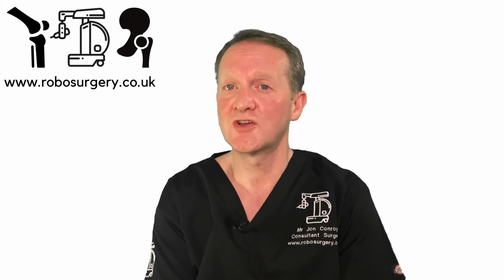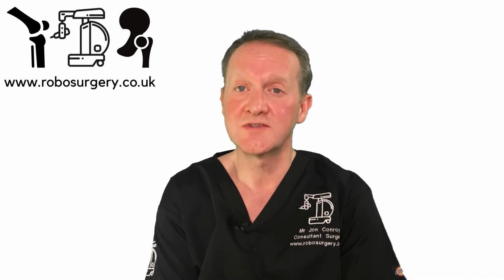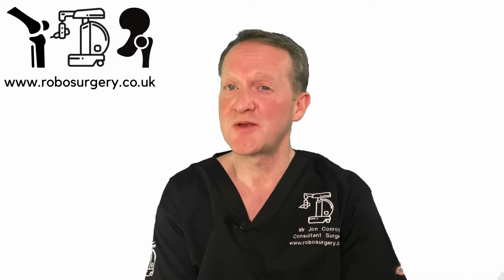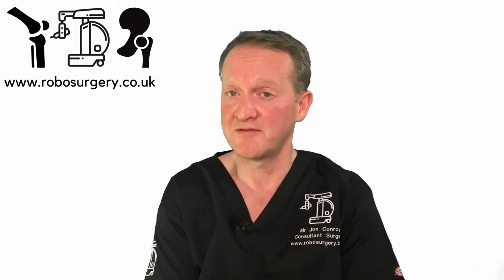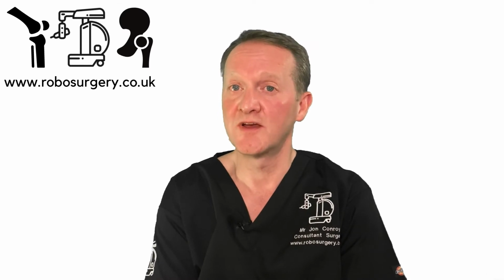It gives the surgeon the confidence when they start the procedure that they know exactly what problems they may encounter. It allows them to know exactly what size implant they have to have available, and it makes the operation run a lot smoother.